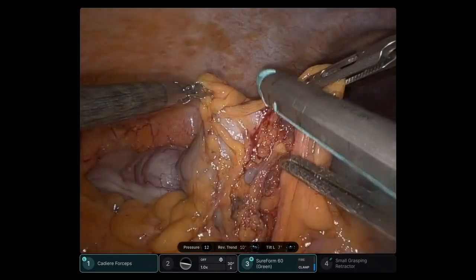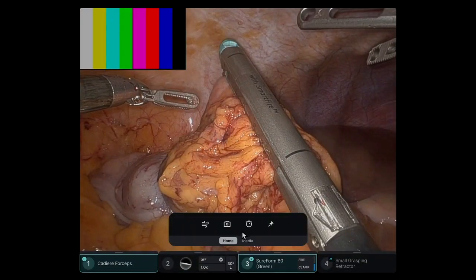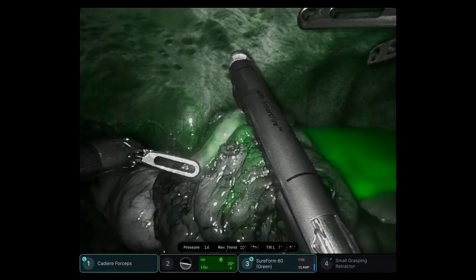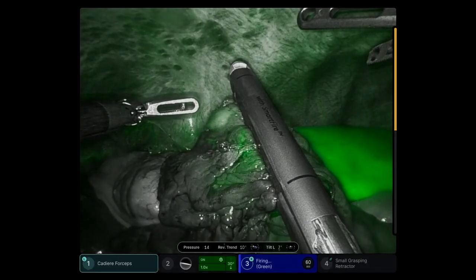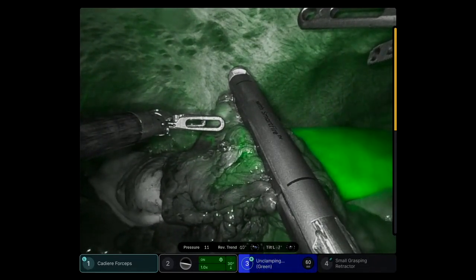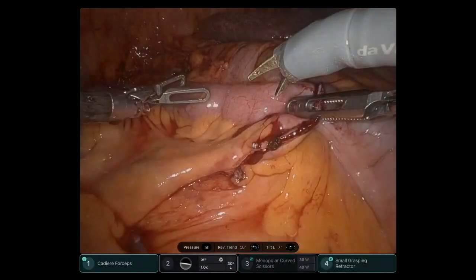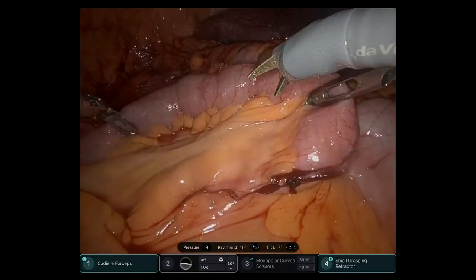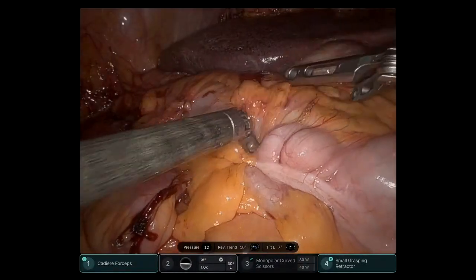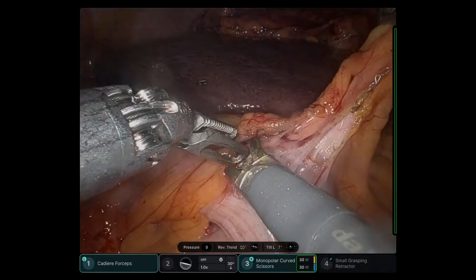This is the tool being guided by the robot. ICG green is activated from the console, and transection can be done safely in an area that has good vascular supply. Another advantage of the DB5 is the force feedback that we get. This is a technology that is in progress but allows us to measure the amount of force we are applying to particular structures, which will help us avoid damage when handling tissues.